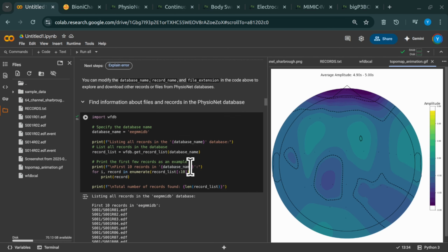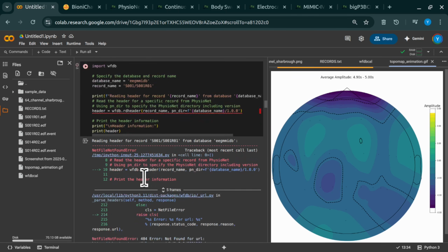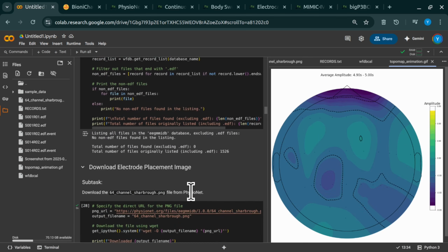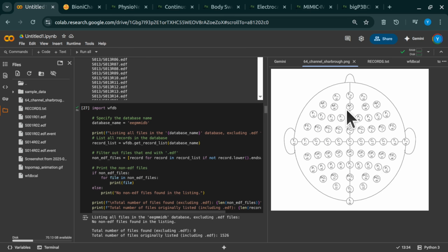Okay, so it's like tuning the radio dial precisely to the station you want. Makes sense. What else is involved in this cleanup? Well, we also took a really close look at the EDF header information, the file's metadata. Like reading the label on the specimen jar. Exactly like that. It tells you vital details, how the data was collected, how the electrodes were referenced, specifics about each channel. You need that context for correct interpretation.